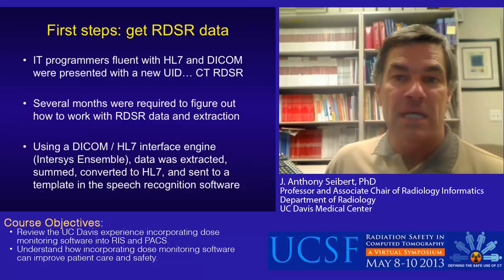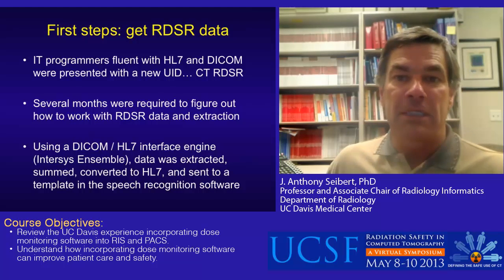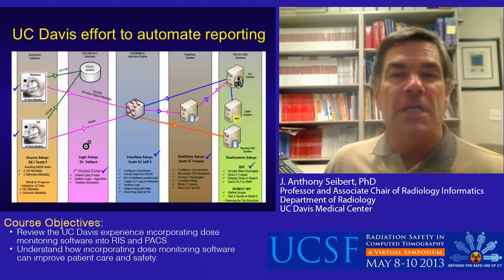An existing DICOM HL7 interface engine was used to accept the RDSR data and convert the extracted and manipulated data to HL7, and then to send the content to a template in the speech recognition software. This is a diagram of the contributors and the progress made during the implementation of automated reporting.